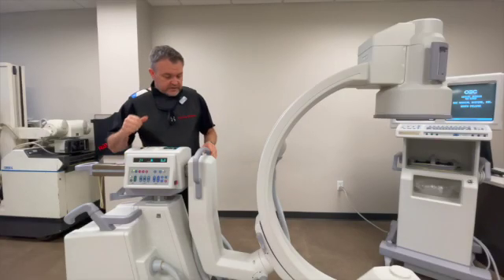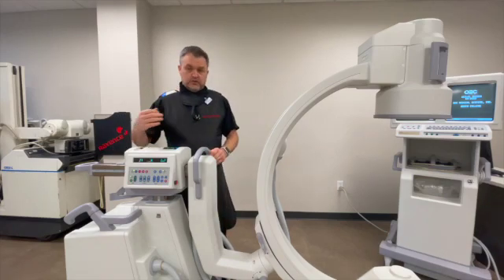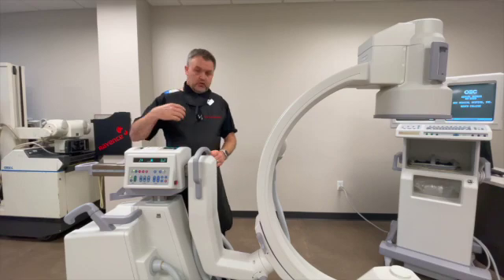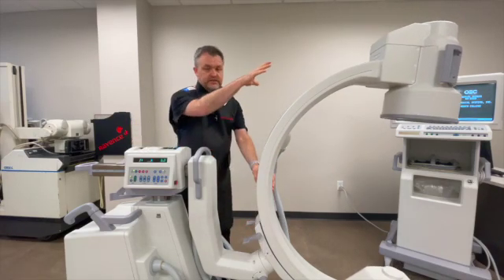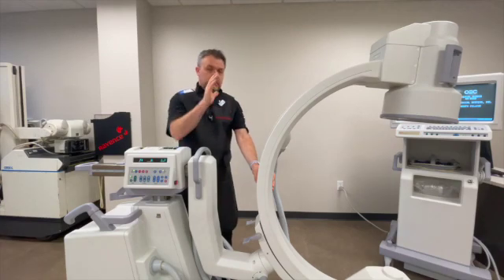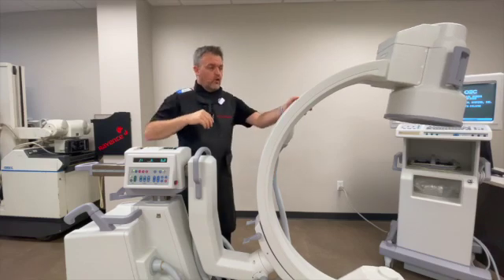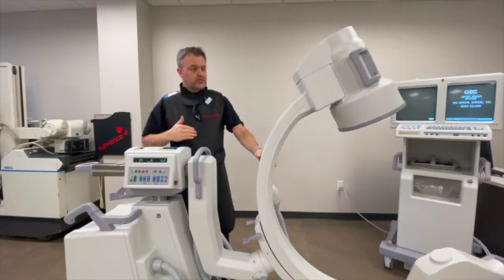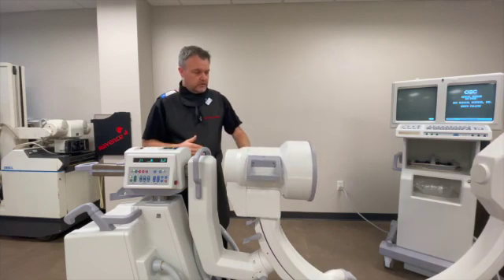The next lock is the C-arm lock, sometimes called your orbital, or your over-scan or under-scan. What that does is it allows the intensifier and tube housing to rotate over if you have to over-scan, or if you're under-scanning into a lateral position, it allows your C-arm to come all the way down — 90 degrees or 180 degrees to the floor.